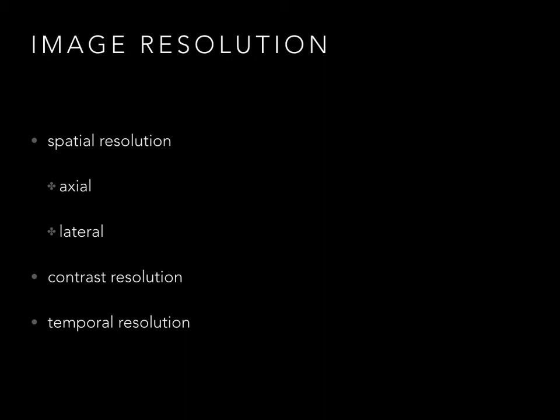Contrast resolution is the ability of the ultrasound machine to differentiate subtle differences in echogenicity between anatomical structures and display these as being different. Temporal resolution is the ability of the machine to accurately show the position of moving structures at a particular instant in time.